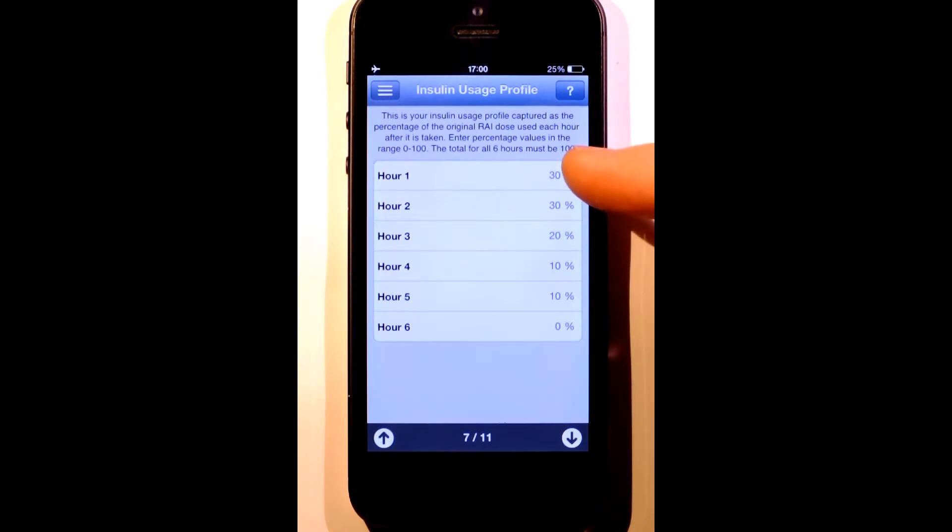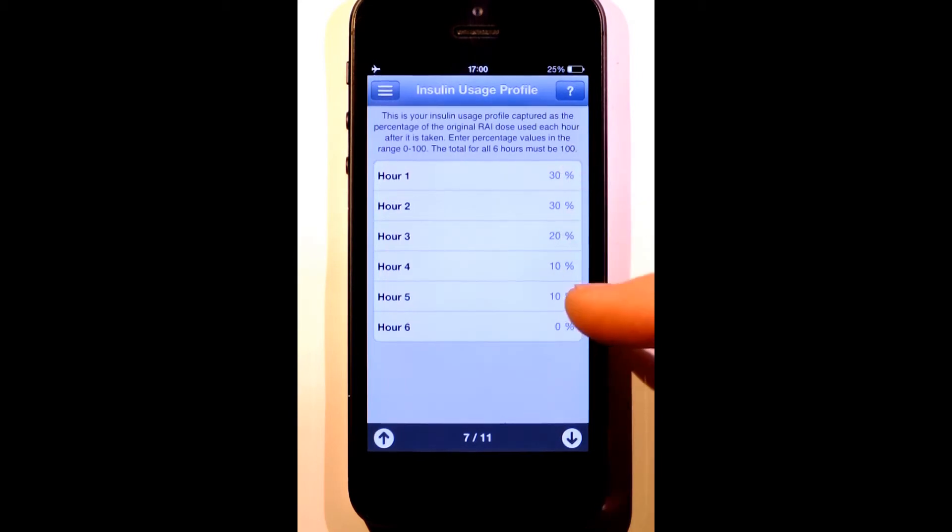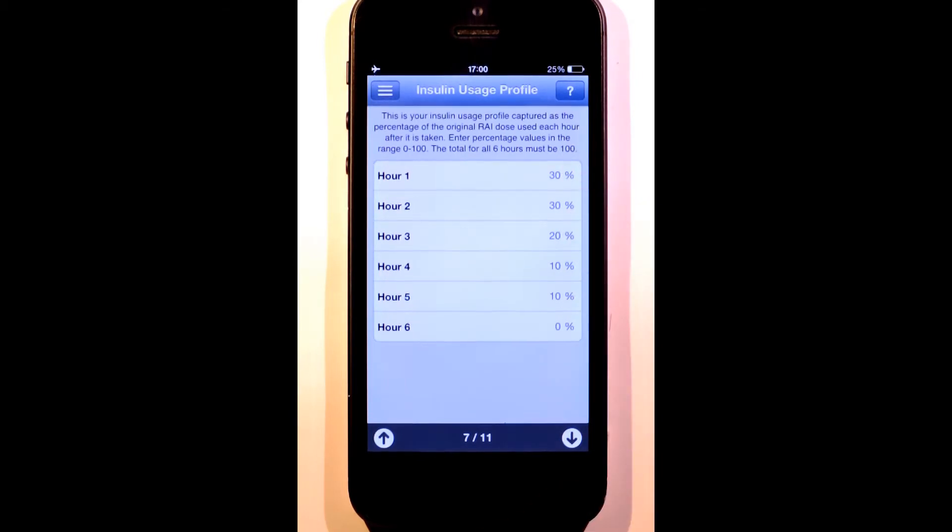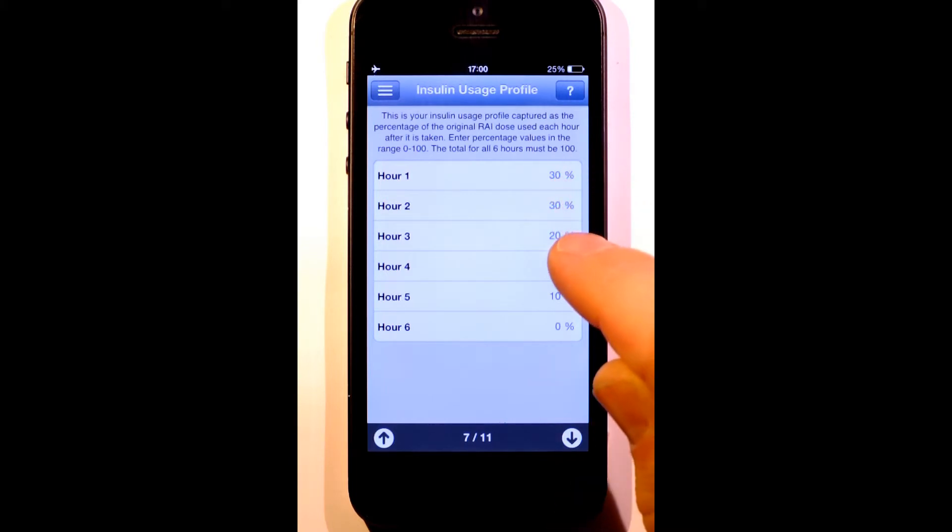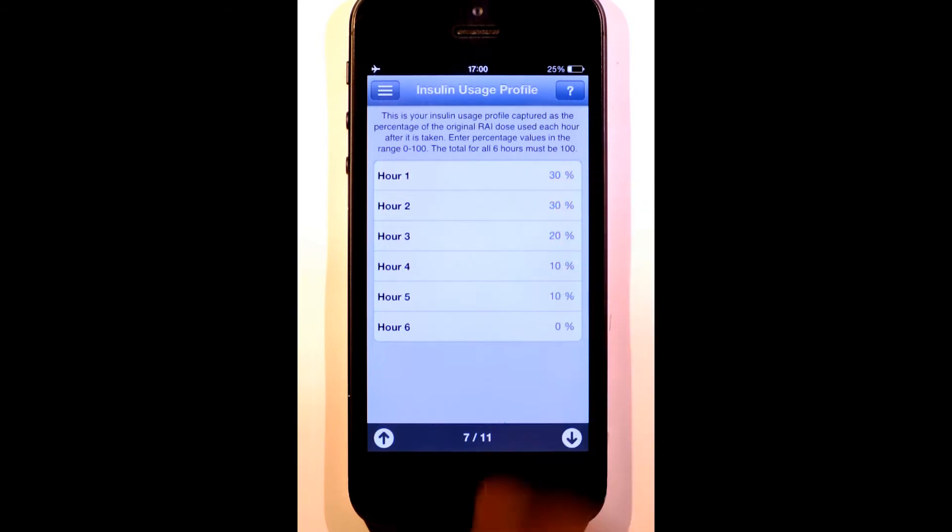For each hour, we specify how much of the original insulin dose was used. How quickly the insulin is used over these 6 hours will depend on the type of insulin and your metabolism. The total of the percentages must add up to 100% over the 6 hours.